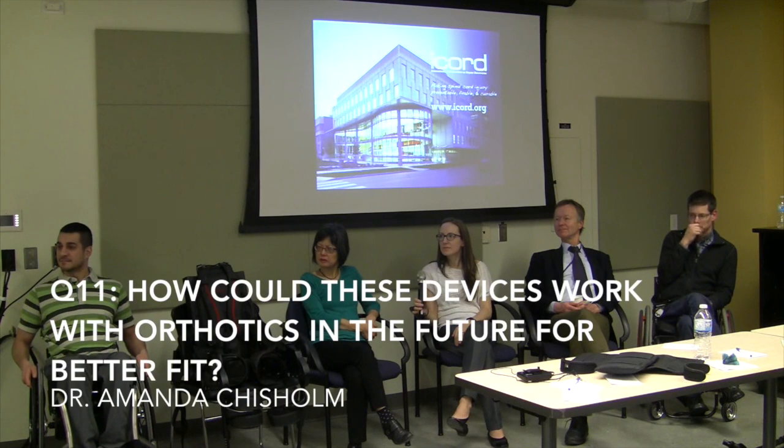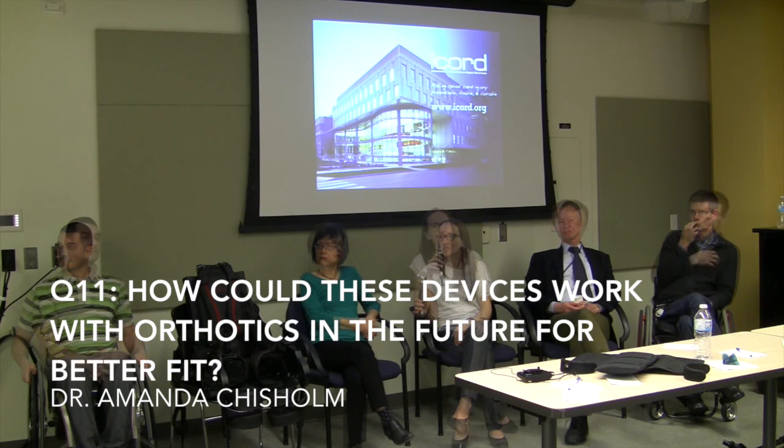Awesome. Next question. Do you foresee a point when this technology works in conjunction with orthotics to enhance fit construction and streamline design? I think the gentleman was wondering whether these exosuits are going to work with technologies like orthotics to improve fit design. I'm not sure about that, but the ankle joint is like a spring-loaded joint, so it does give you some motion depending on the type of orthotic that you have. You can get some movement at the ankle joint.